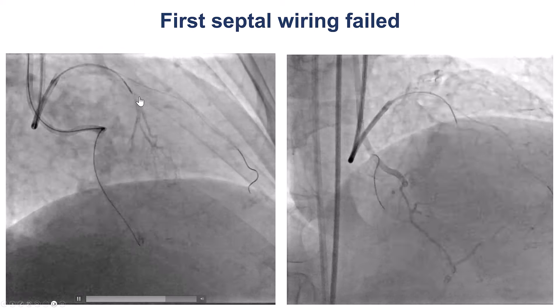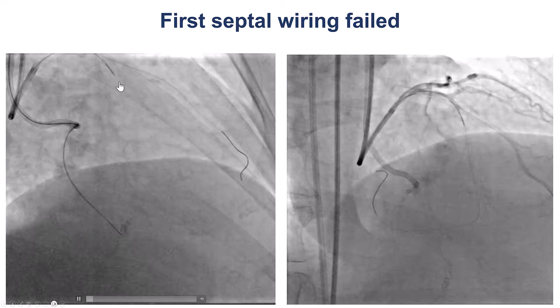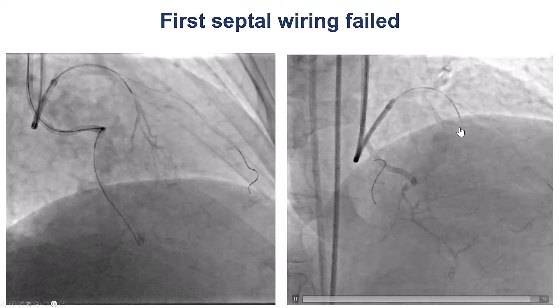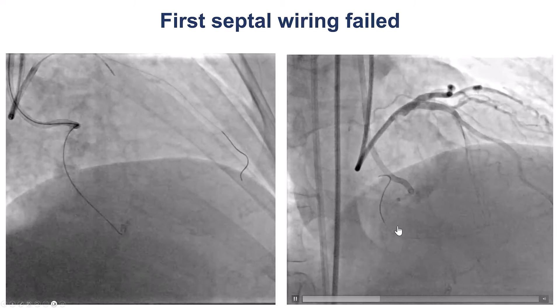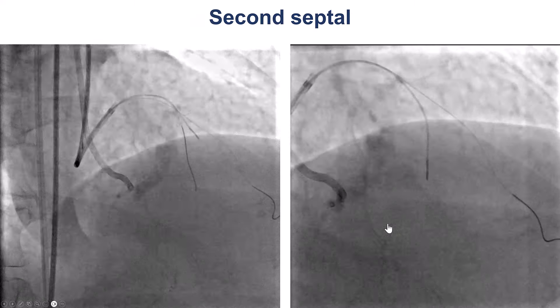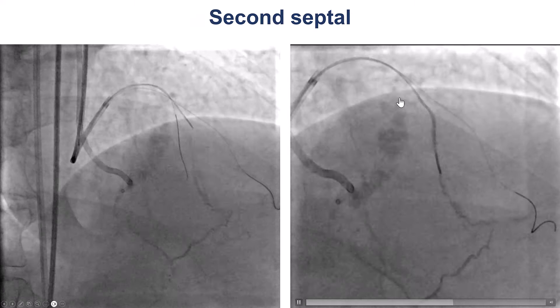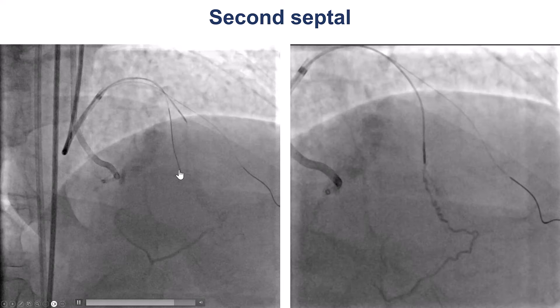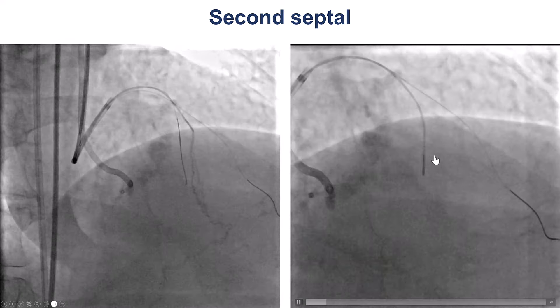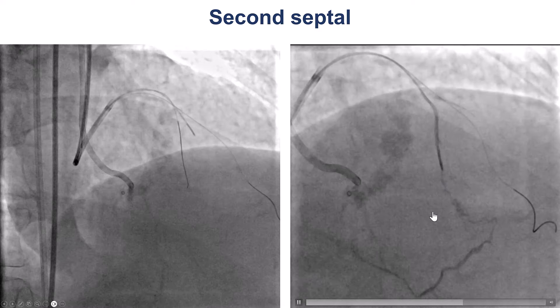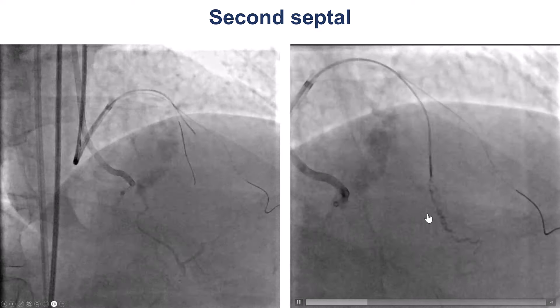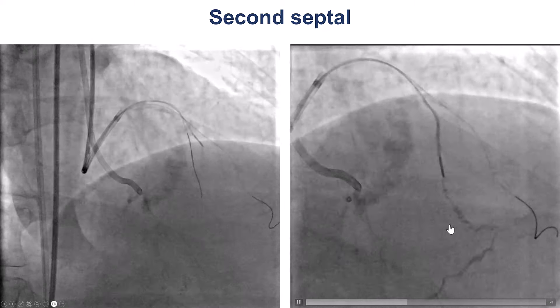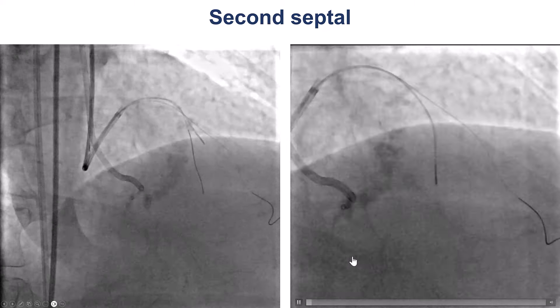We tried to go through the first septal, but selective injection didn't really show a good connection, and sure enough, when we tried to cross it, we were unable to get through. We then tried to go through the second septal and also had difficulty when we tried to surf. However, once we did a selective injection, we saw a nice connection despite tortuosity and high-frequency curves, with a continuous connection going to the PDA.